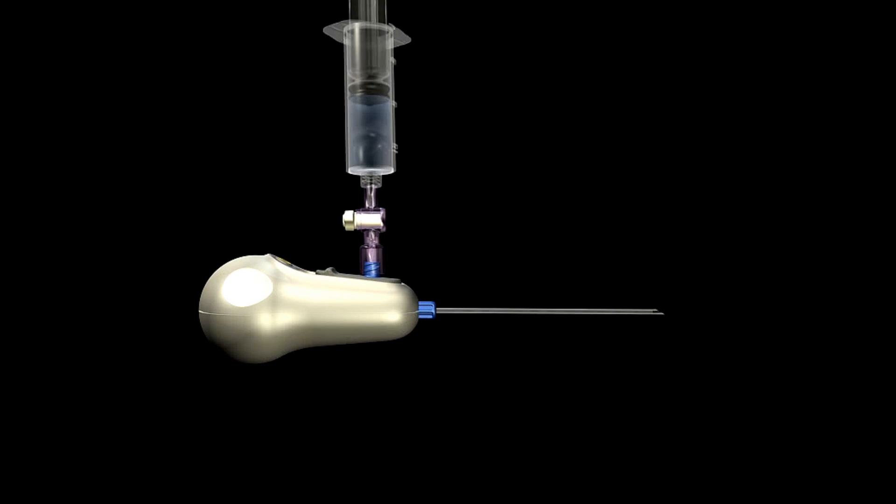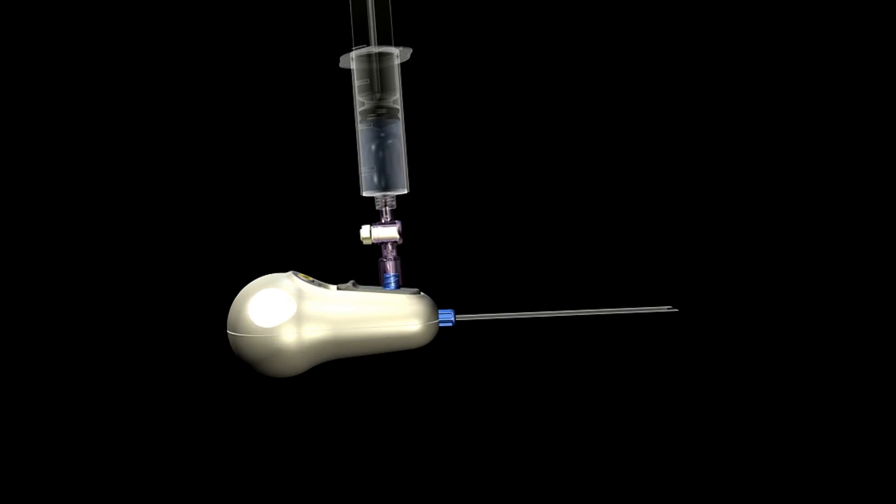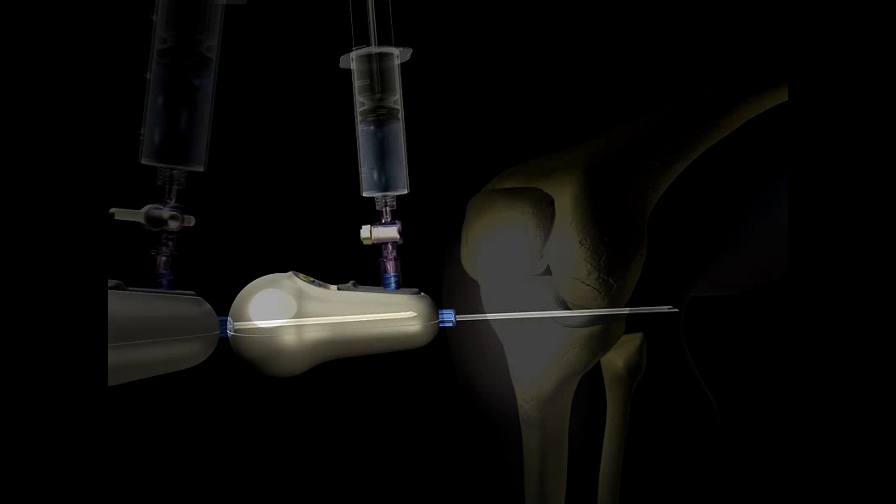The MyEye's fully integrated design eliminates the need for a traditional trocar and cannula system, often required in diagnostic arthroscopy. A flushing port is conveniently located on the MyEye's handle to allow for on-demand fluid delivery to clear the field of view.